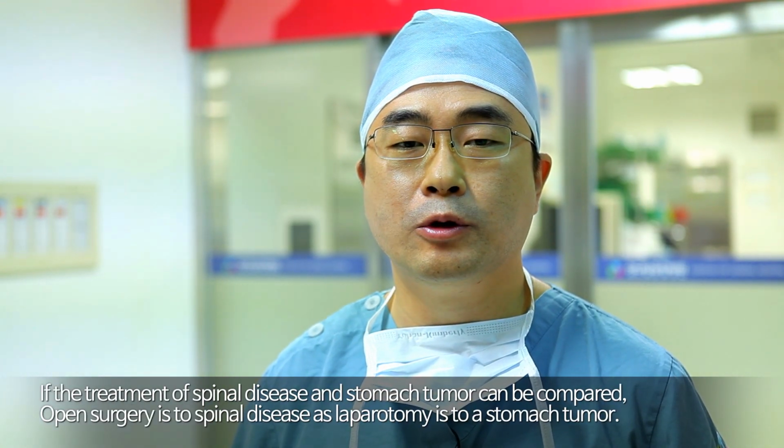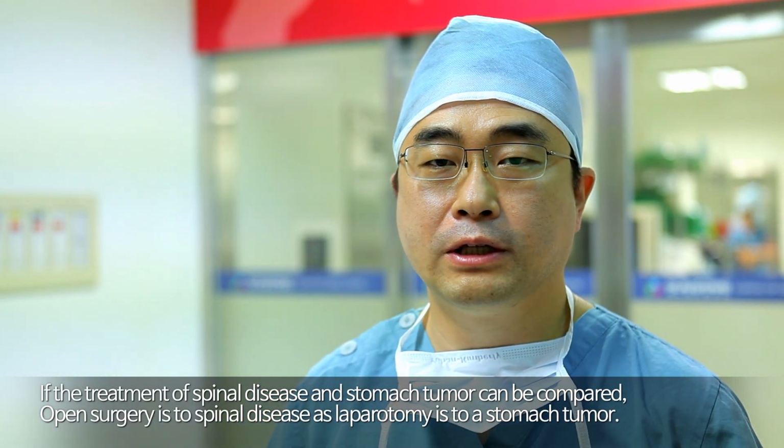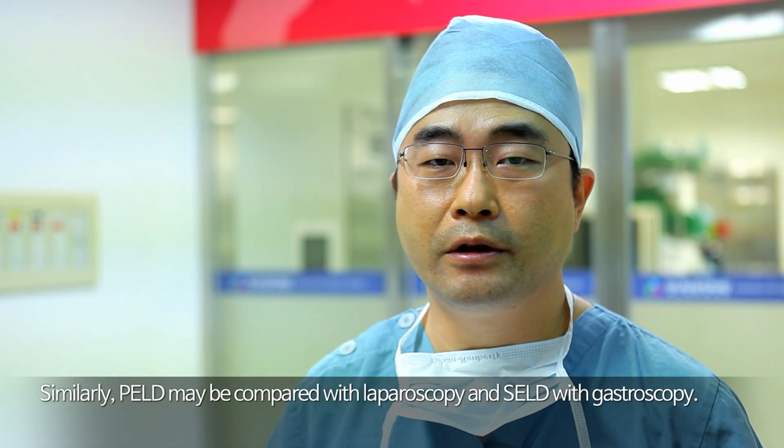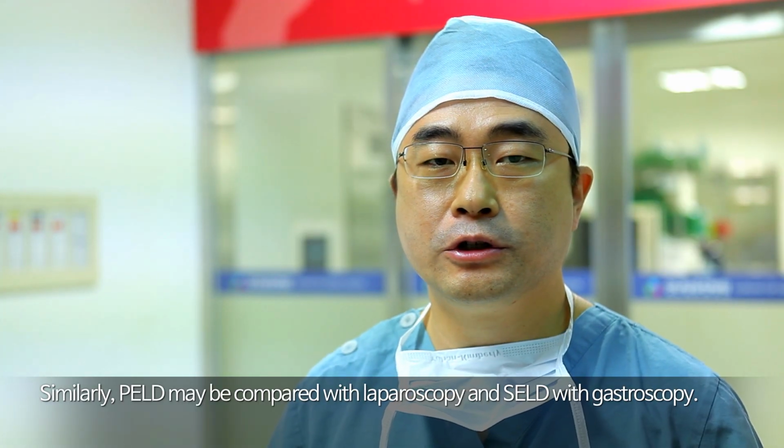If the treatment of spinal disease and stomach tumor can be compared, open surgery is to spinal disease as laparotomy is to a stomach tumor. Similarly, PELD may be compared with laparoscopy and SELD with gastroscopy.